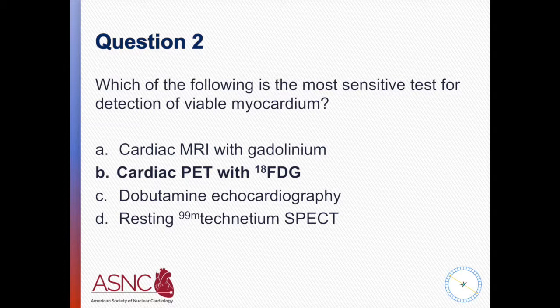And then at higher doses of dobutamine, the same myocardial region becomes akinetic again, suggesting ischemia. So this type of biphasic response, which is rarely seen but very helpful in predicting improvement with myocardial revascularization, but dobutamine echo in general is less sensitive. It's specific but less sensitive for detecting viability.